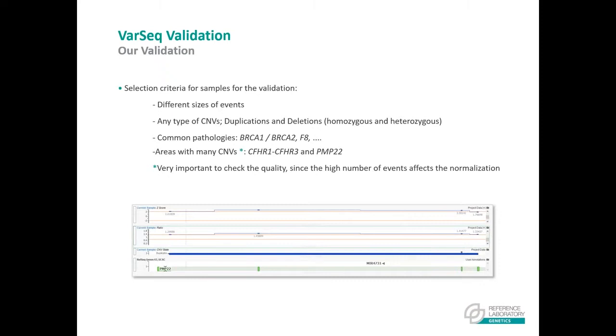Multiple samples with this kind of events were incorporated into the controls. As we can see in the figure below, the analysis of these regions may seem complicated, but thanks to a high number of controls, the software is able to identify those CNVs in these regions.